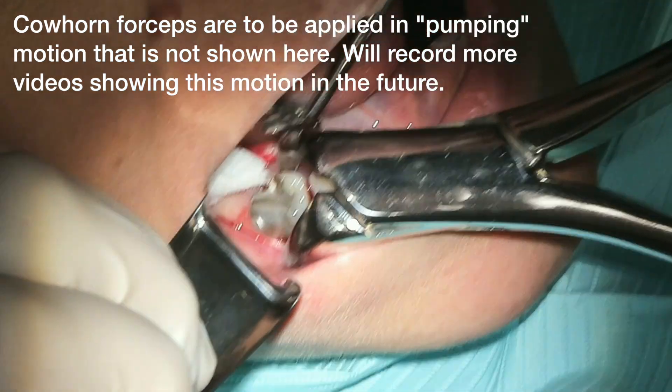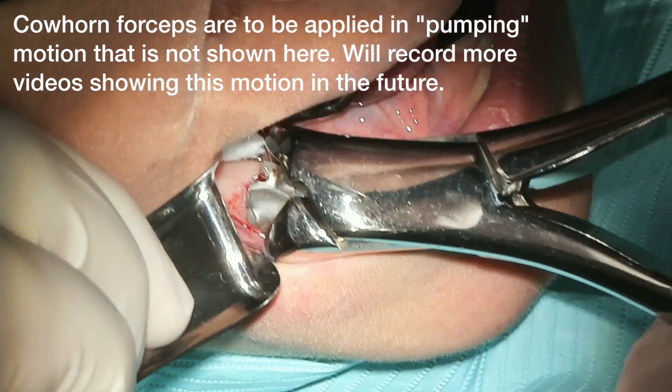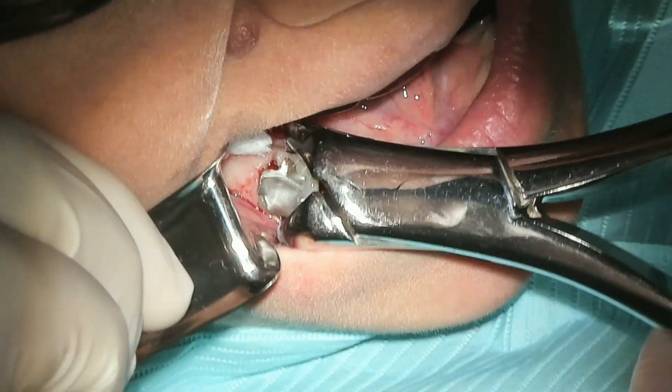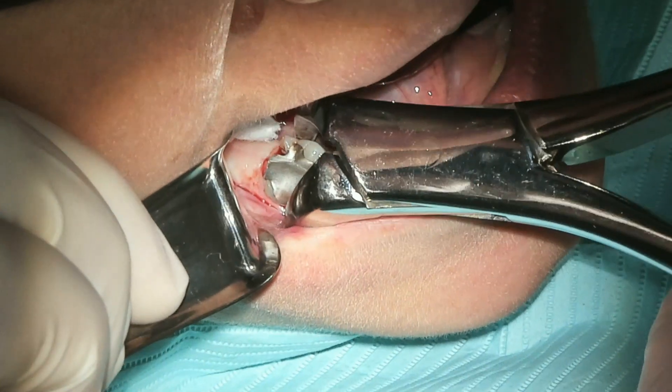Here we have lower cow horn forceps. The most important thing about using cow horn forceps is case selection. We already have so much movement here that realistically we could have used the 151 forceps — the lower universals.